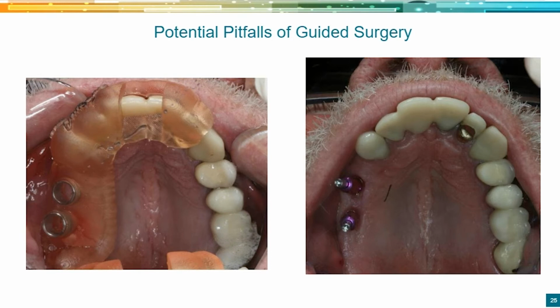And so it wasn't until the patient's impression appointment that I noticed that the angles were off. Clearly, these are not parallel, and they were planned to be parallel. So the anterior implant in the number 4 site is actually placed correctly. That's the angle we were hoping to do, and the final restorative plan was always to put a cantilever bridge off the 2. So number 5 has a pretty large horizontal defect.